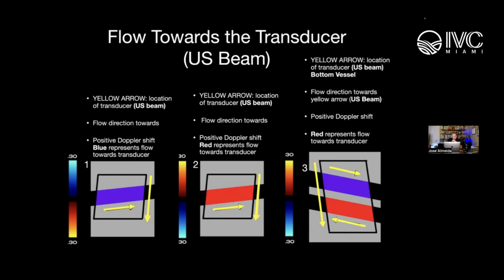If you were to put the yellow line pointing down on the opposite side of the box, starting in the upper corner, and put your finger straight down, it's going to go inside the box. So that's not where the transducer is. Some people call it home.